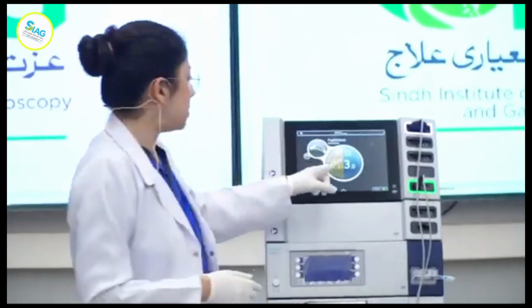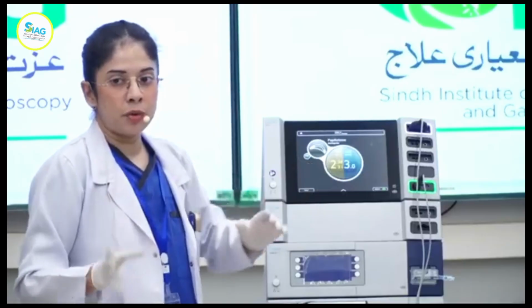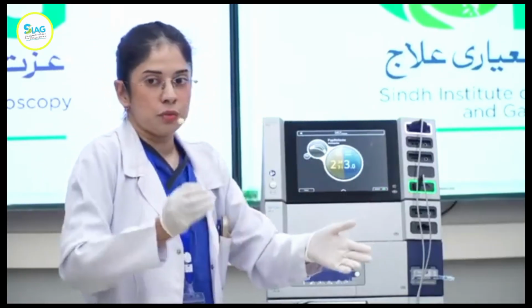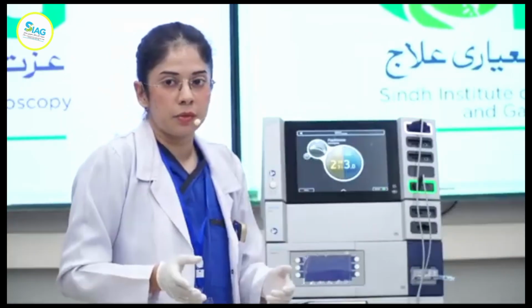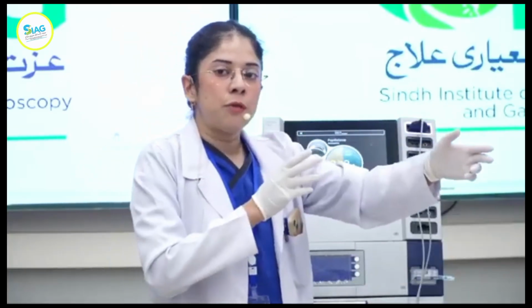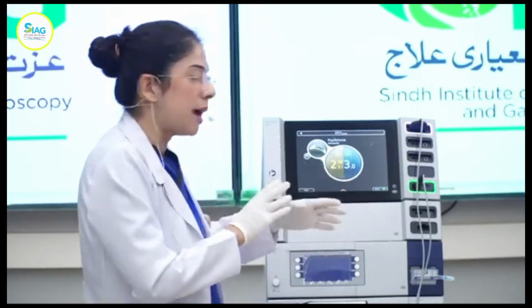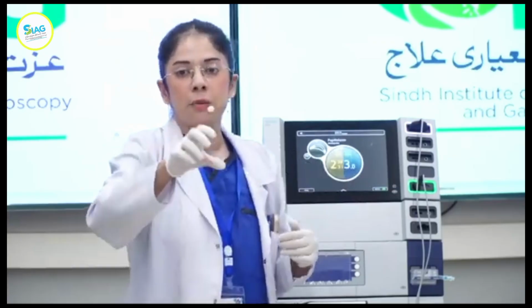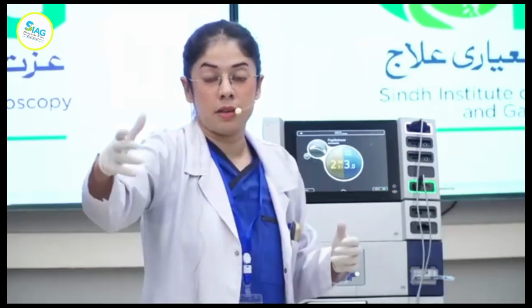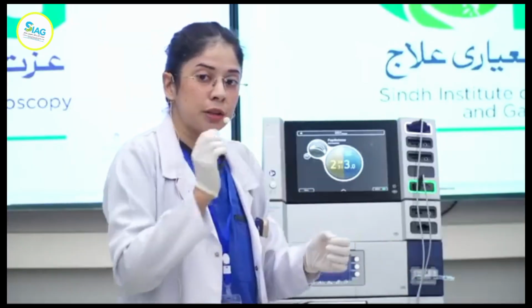So over here, I'm going to use the standard setting. Effect can go up to 6. Mostly institutes will say play with 2 and 3. Every time somebody tells you to use effect 3, what I usually used to do was just reduce it once, just to see what the difference is. Not really on a live patient, I actually did this experiment, just so I know that when they're saying 3, of course, the manufacturer has a preference. Everybody likes to follow the manufacturer setting. But in our institute, we do try to see what we're comfortable with. And you'll see in most articles, it's up to the endoscopist's discretion. That discretion is basically you experimenting. This is a good experiment. It'll show you the difference.